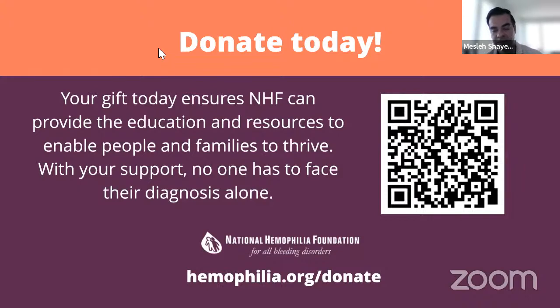I think one of the useful things that I may not have highlighted as much is that particularly in an older adult, once we have a lot of arthropathy, it can become a little bit difficult to distinguish whether the pain is from the arthritis versus the bleed. There have been a lot of studies that have shown that as you grow older and the joint becomes so much damaged, it's hard to distinguish between those two different types of pain. So sometimes pain does not necessarily translate to a bleed. So this is one of the ways the ultrasound can be helpful: to look at blood products and distinguish between bleeding versus no bleeding.